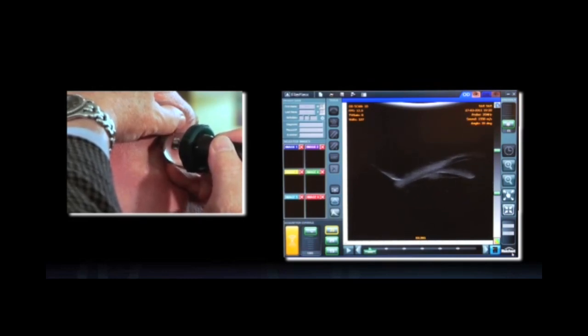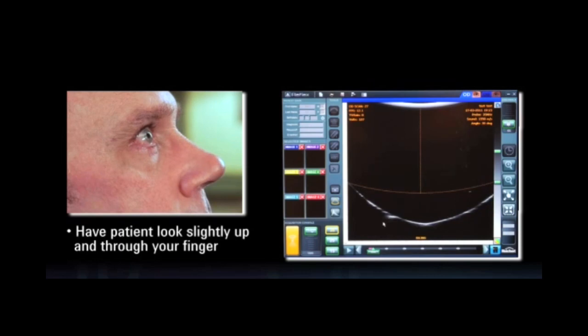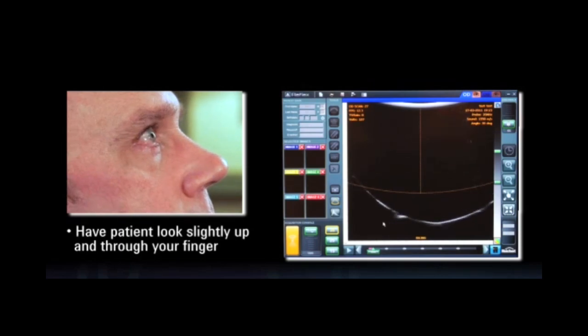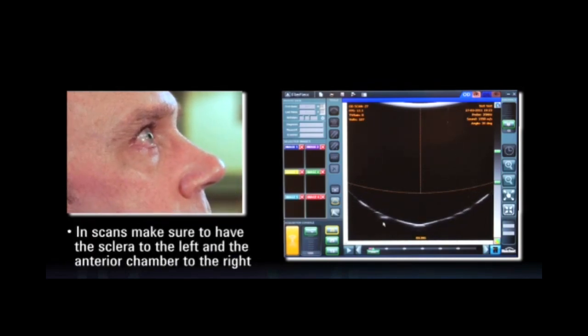Okay, let's freeze that. My criteria for an adequate scan is I have to have a landmark in each picture. That landmark is the pupil being open. I don't want to be above the pupil or below the pupil. I always want to go through the pupil, which is evident right here. I'm going to look at the inferior angle. I'm going to have the patient look slightly up, look through my finger. The line is going to be facing at 6 o'clock down here. In my images, I always like to have the sclera on the left and the anterior chamber on the right.